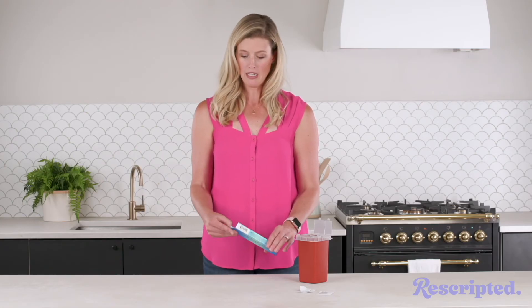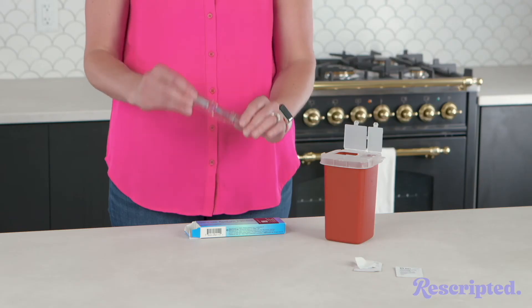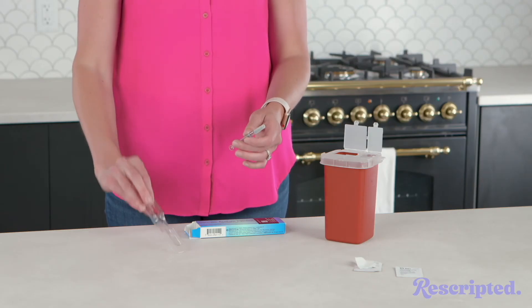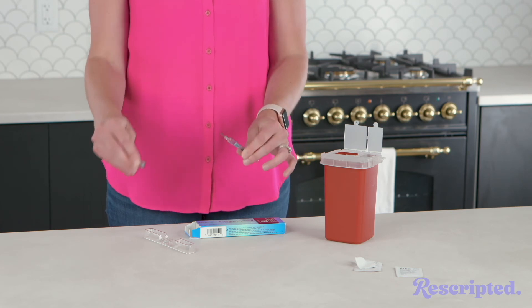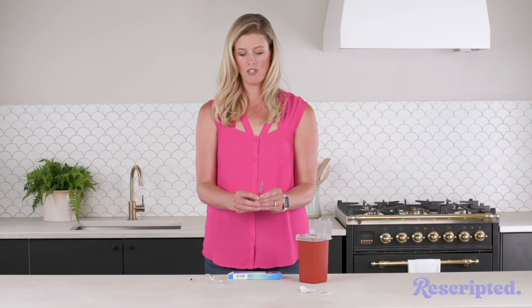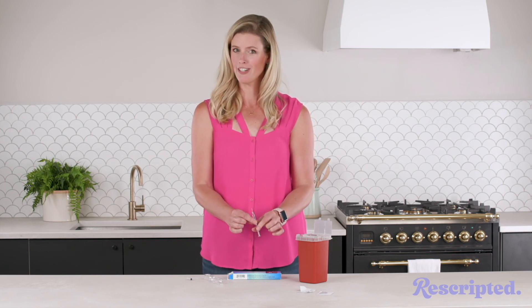The first step is to open the box and then just take out this pre-filled pen here. You can see it has liquid in it and then you're just gonna pop off the lid. If there's any air at the top just kind of push the air out and then you're ready for your injection. Easy peasy.